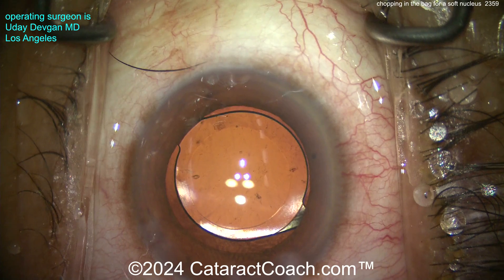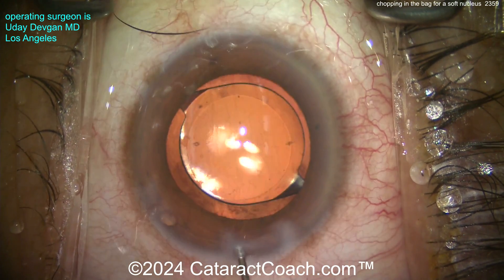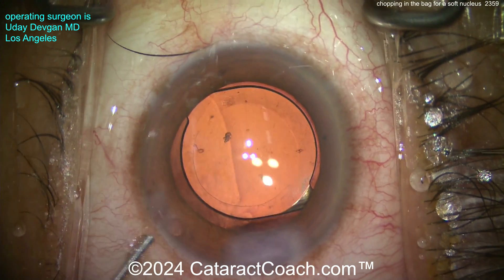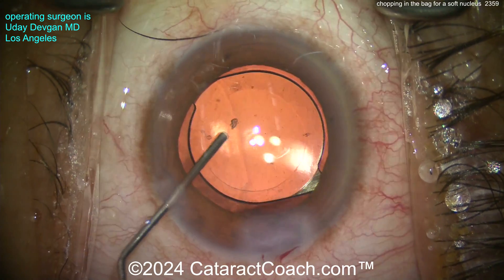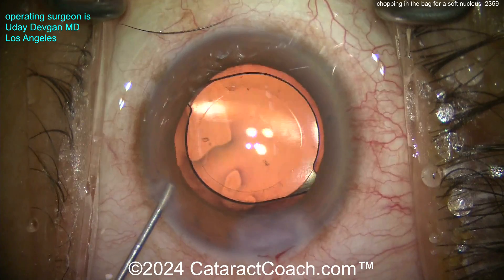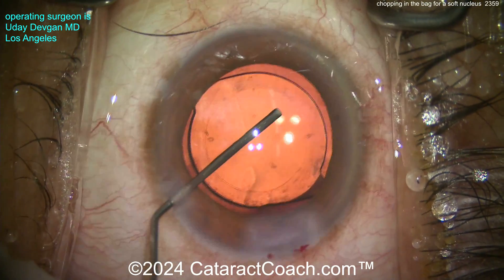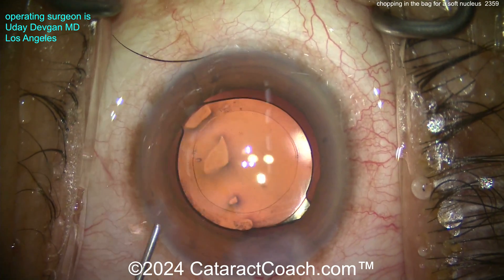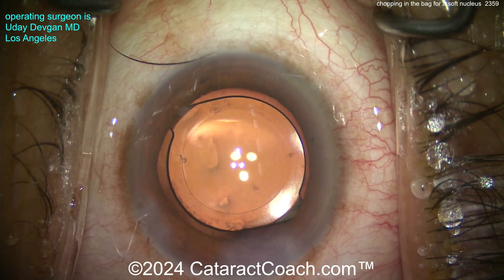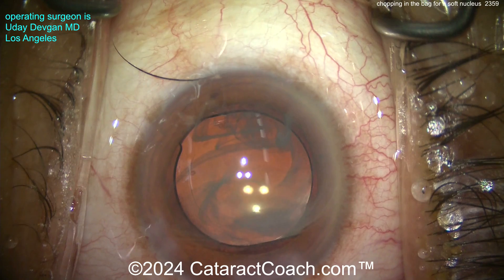Actually, looking right behind the posterior capsule — it's all cleaned up. I thought there was a tiny nuclear chip there, but no, that was in the anterior chamber, all removed. This patient has totally normal zonular support; everything looks great. Sealing up the incision — just a little hydration on the roof, that's enough. Go inside with the BSS, center up that lens, remove any tiny fragments. Oh, there's one eyelash on the surface of the eye — I'll use a sponge to sweep it off the field.